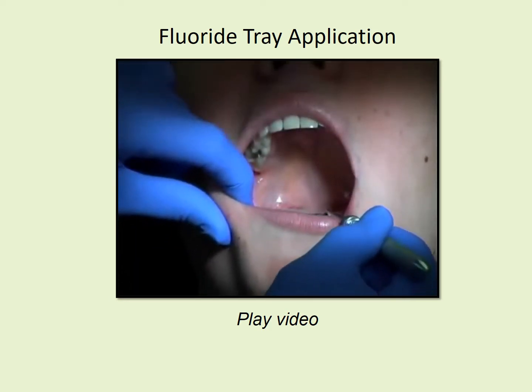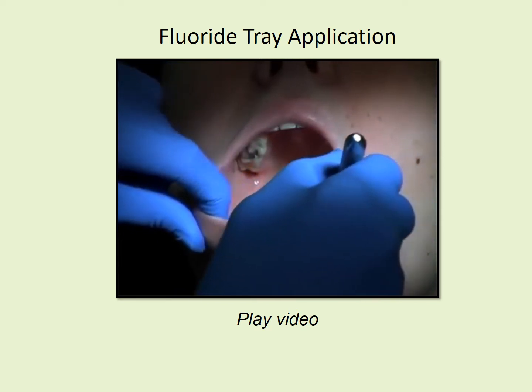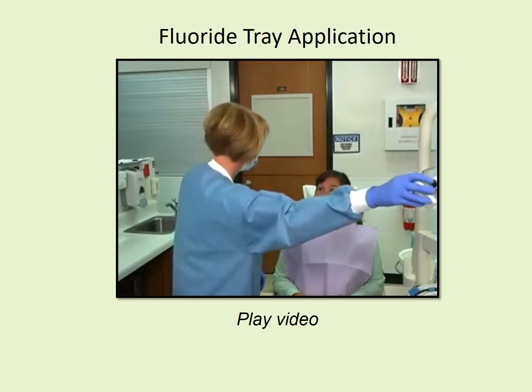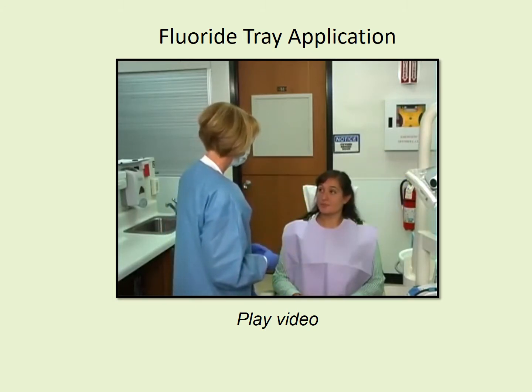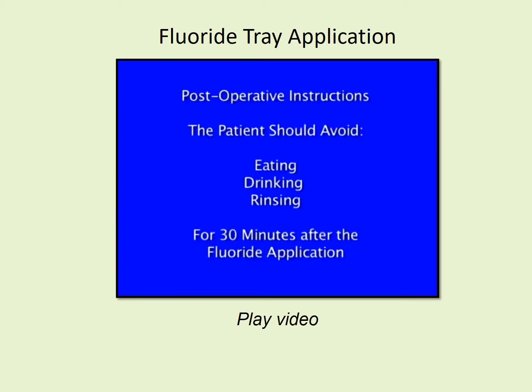Utilizing a mouth mirror, inspect the oral tissues for any reactions that may have occurred. Ask the patient whether they are experiencing any burning, tingling, or irritation. Give the patient the postoperative instructions. The postoperative instructions are that the patient should avoid eating, drinking, or rinsing for 30 minutes after the fluoride application.